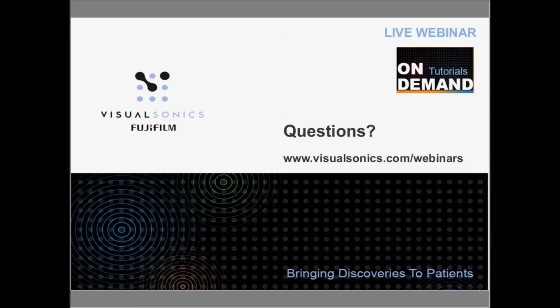I tend to like gel that's a little bit thicker. I find with the heated platform underneath the animal, and sometimes using a heat lamp above, the thinner gels tend to melt and kind of run around a little bit, but that's just me. I know other people, I know one of our application scientists specifically, who likes to use thinner gel and likes to have the transducer almost right down on the animal's skin and have almost no standoff at all.